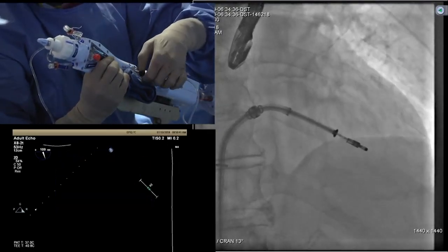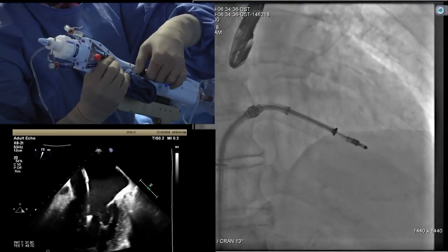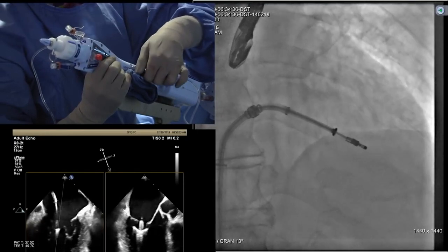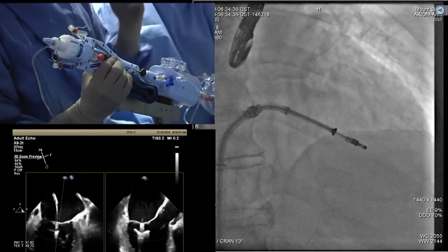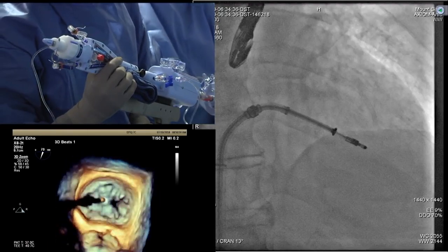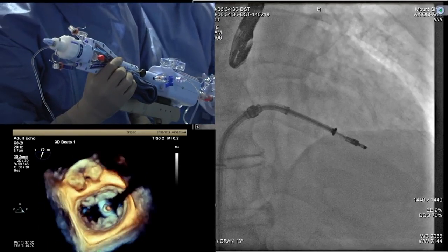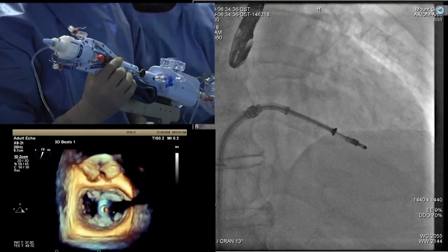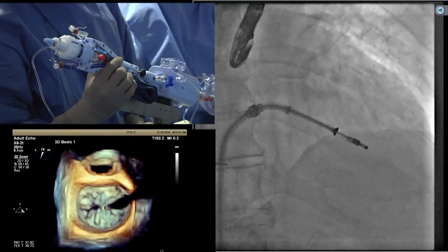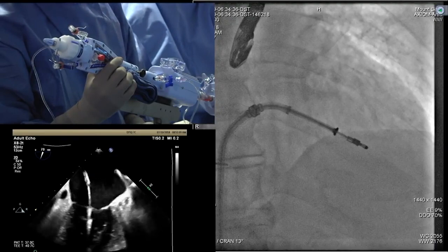Almost. More? No, no, she's saying ask Philip. Philip, what do you think? We're good? I think you're very good. And it's very important to be gentle when you do this under the valve, not to cut into the chordae and muscle, but you did perfectly. Ready to grasp? Everybody agree? Yes, nice.